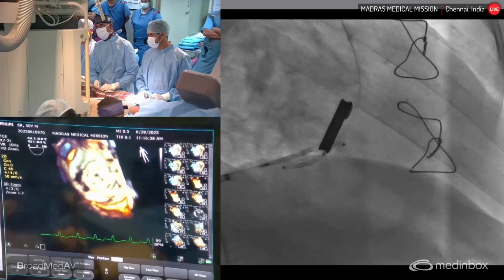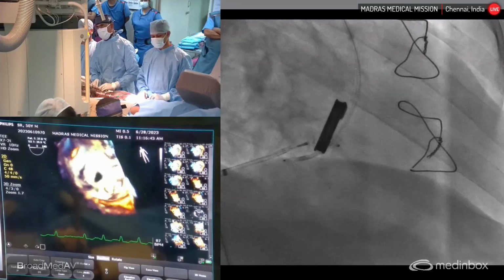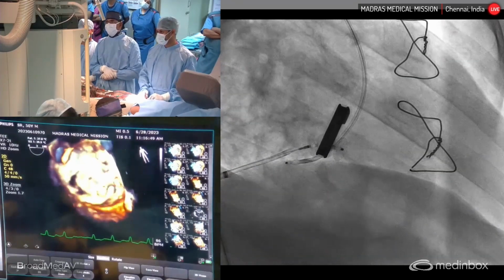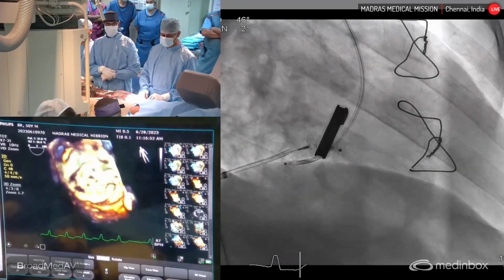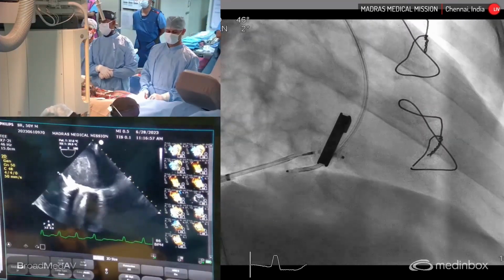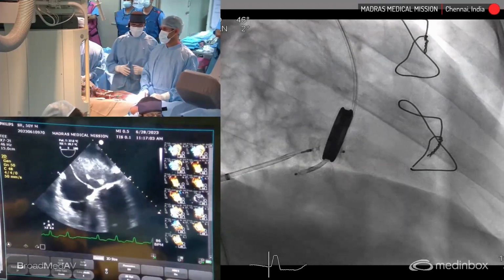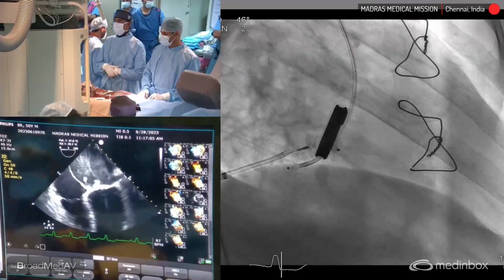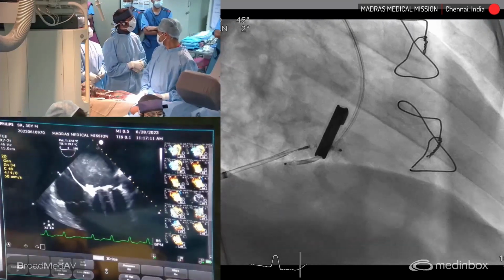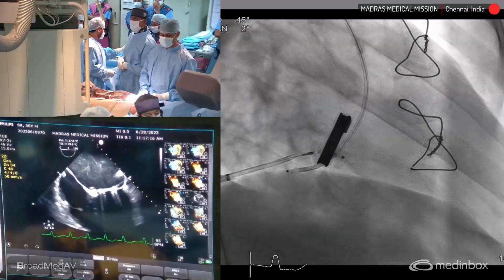At this position, I'm slowly peeling back. Let us now see the 2D picture. Since the paravalvular leak is getting closed, possibly there is a lot of spontaneous echo contrast. Shall we check one ACT right now? It's about 40 minutes from the time we gave the heparin at 9:35. So now it is 10:15, around 40 minutes now.